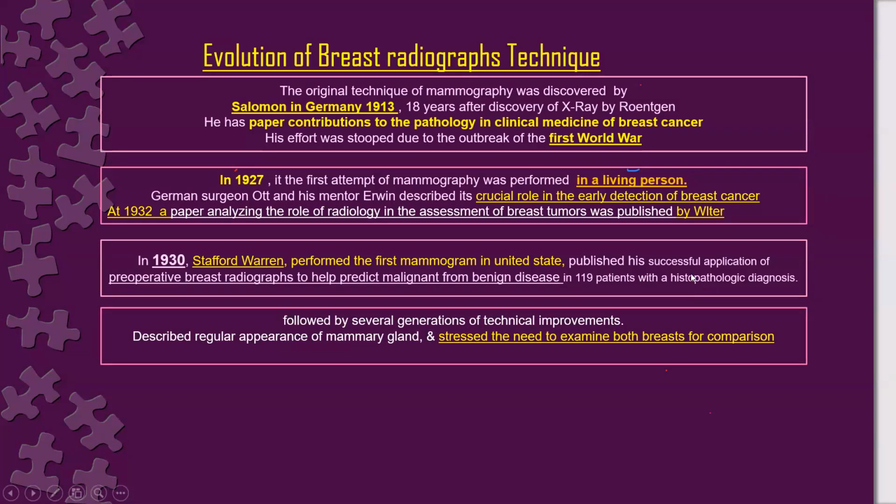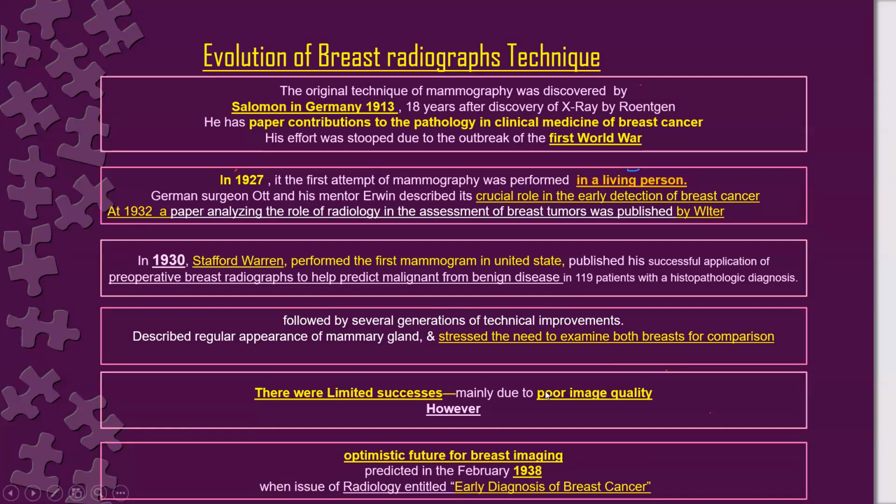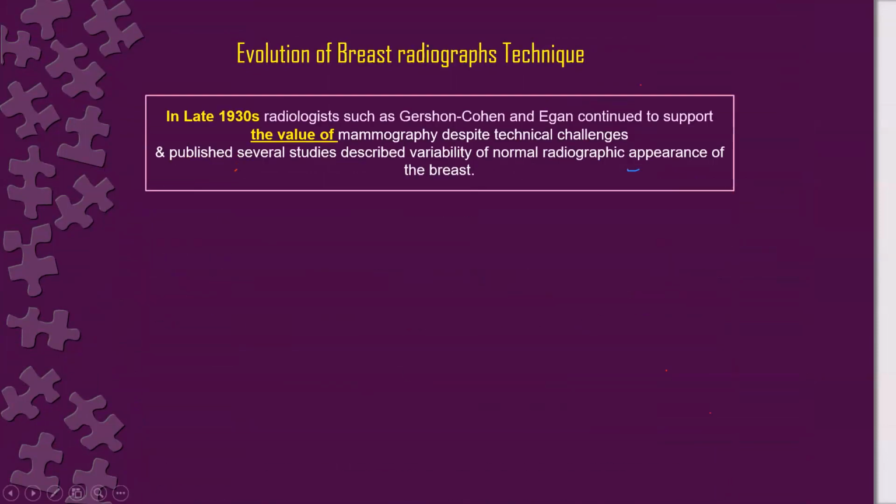Then these were followed by several generations of technical improvement, describing the regular appearance of the mammary gland and stressing the need to examine both breasts for comparison. There were relatively limited successes due to poor quality images. However, an optimistic future was predicted in February 1938 when an issue of Radiology was entitled Early Diagnosis of Breast Cancer.